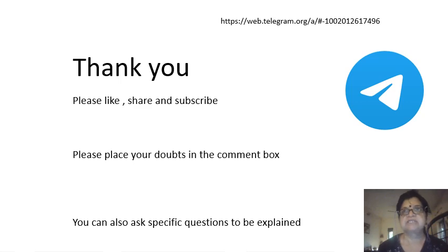So we discussed a few MCQs with some explanation, and I also showed you the other options, what type of imaging they will have. So it is not that we just tick the right answer. The other options were also given explanation why they are wrong and what exactly you find in those options. Keep posting your doubts.